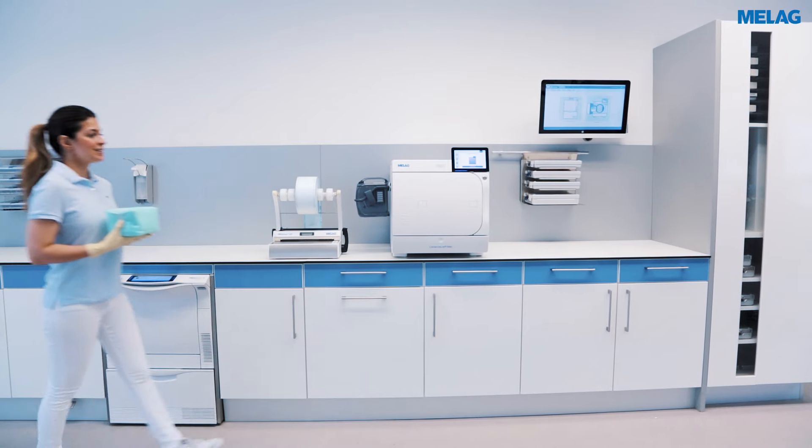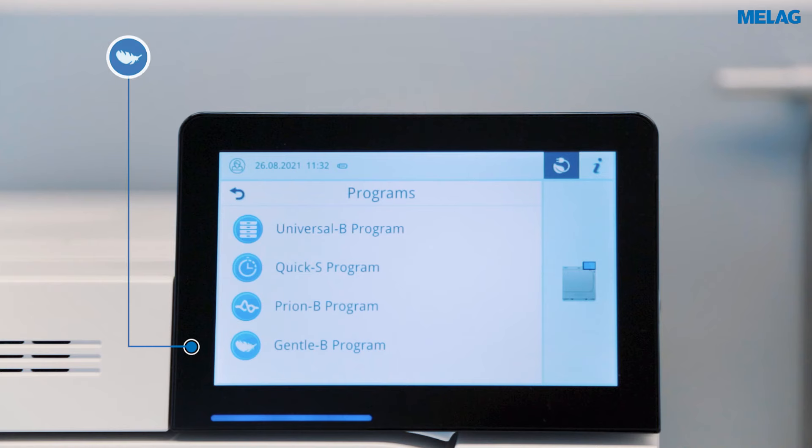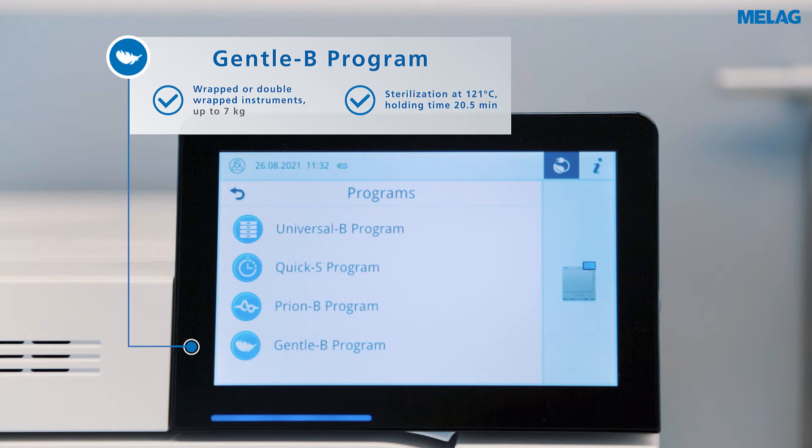For textiles and thermolabile items, please select the Gentle B program. In this program, sterilization is carried out at only 121 degrees Celsius.